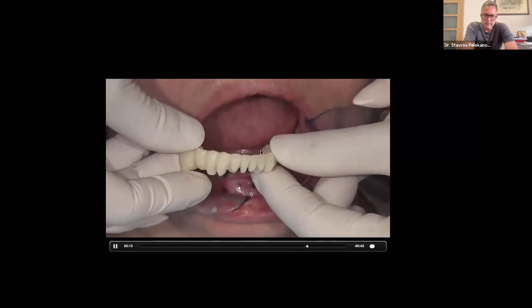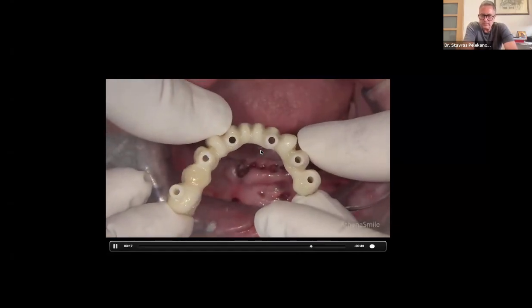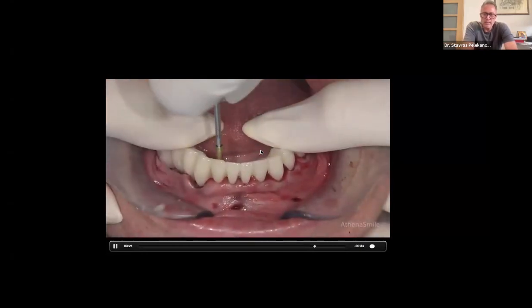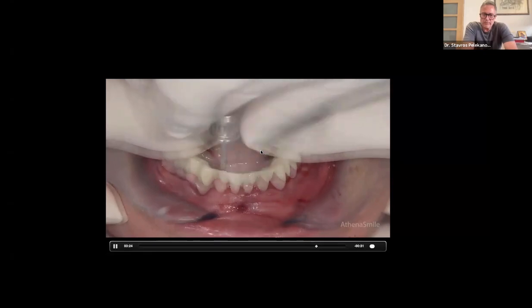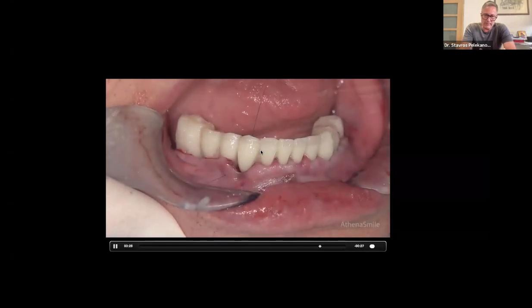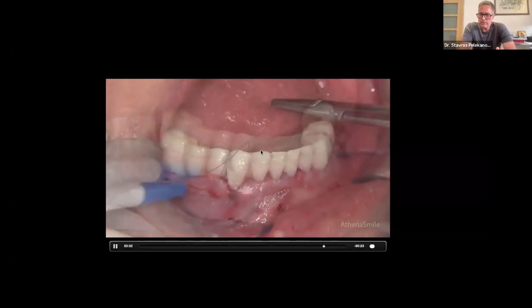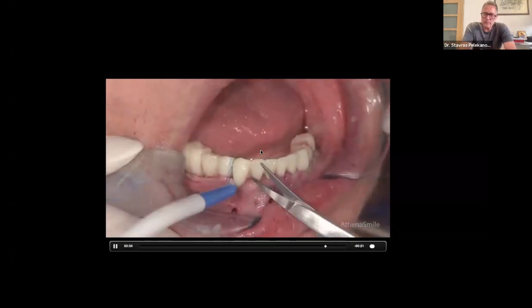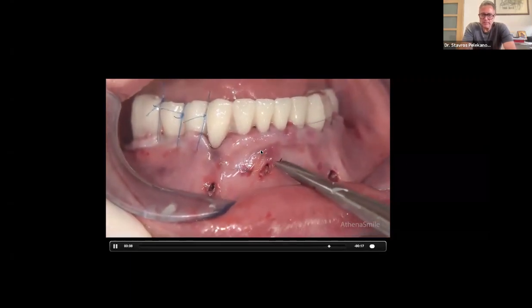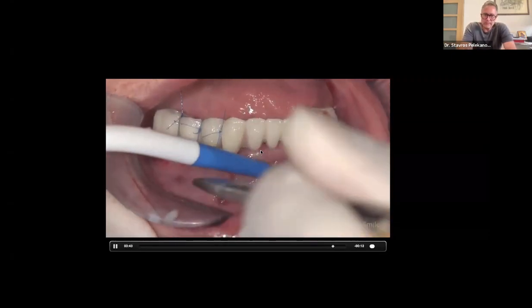And in a very short time, usually this is not more than 2 hours. Sometimes it's 90 minutes, sometimes it's 2 hours. The goal is to deliver the final designs. That's why you see we are really predicting the final design on day one, because I want my soft tissue to heal around my design. I don't want to change designs.